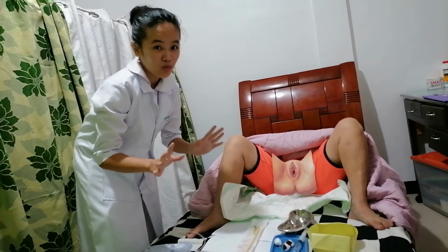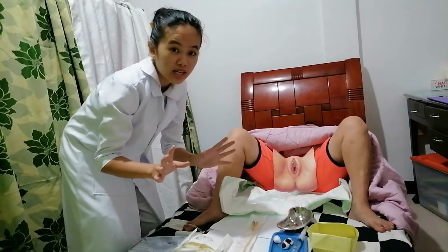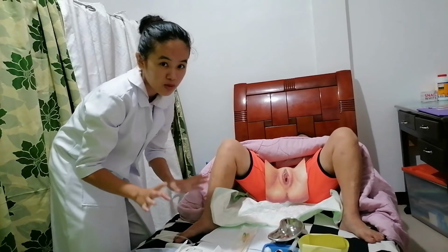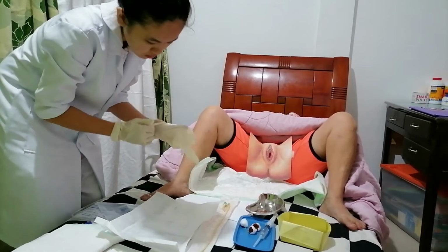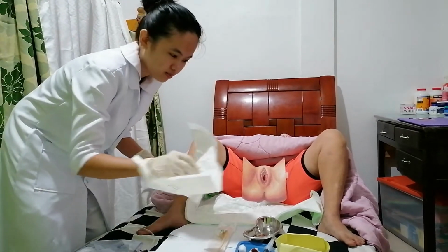And now, I'm going to wear my gloves, carefully not to touch the sterile area in the gloves part. And then, discard this one.